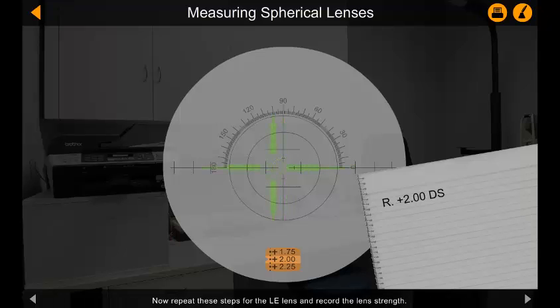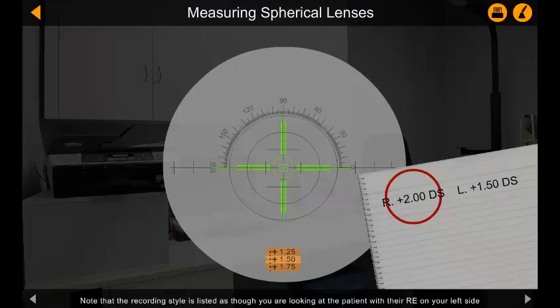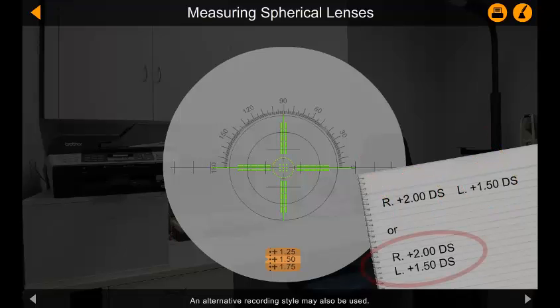Now repeat these steps for the left eye lens and record the lens strength. Your final lens prescription should look something like the prescription shown in this example. Note that the recording style is listed as though you are looking at the patient with their right eye on your left side and their left eye on your right side. That is, the view is laterally inverted. An alternative recording style may also be used. You have now completed measuring and recording the strength of a pair of spherical lenses.